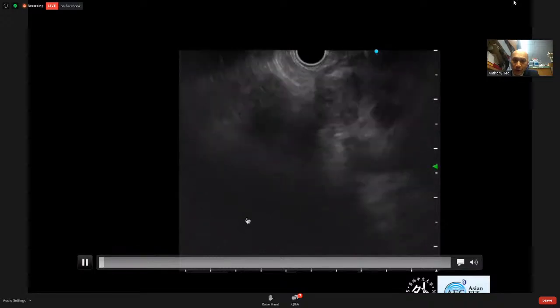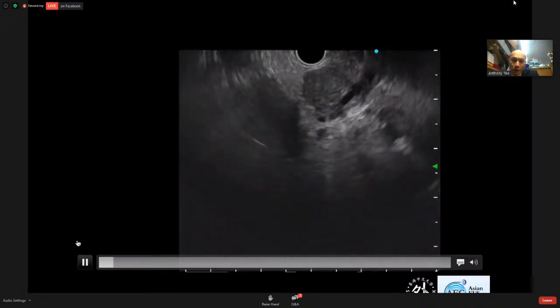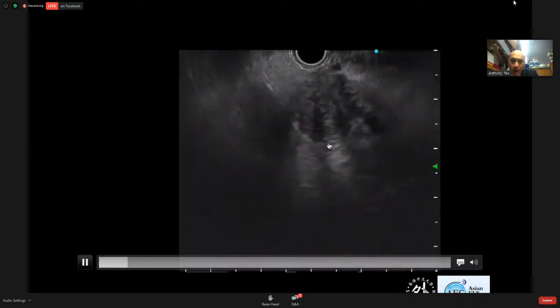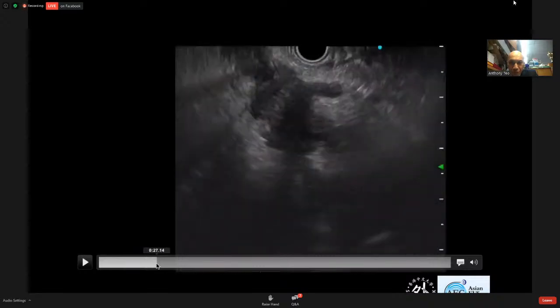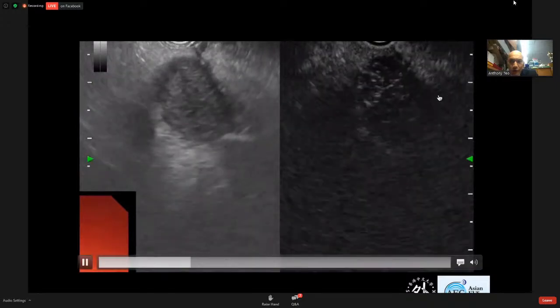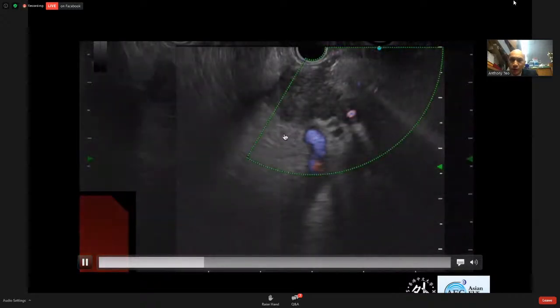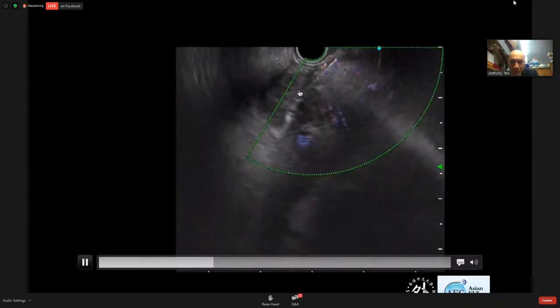So this is a patient with unresectable pancreatic cancer. We have a protocol to evaluate the efficacy of radiofrequency ablation. This is a tumor. The needle will come in from here. So this is a pre-procedural contrast imaging. We want to see the viability of the tissues in the tumor. And then the needle will be inserted. There is a needle.